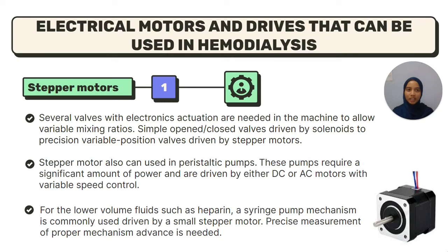Electrical motor and drive that can be used in hemodialysis. First is the stepper motor. Several valves with electronic actuation are needed in the machine to allow variable mixing ratio, from a simple open or close valve driven by a solenoid to a precision variable position valve driven by a stepper motor. A stepper motor can also be used in the peristaltic pump.